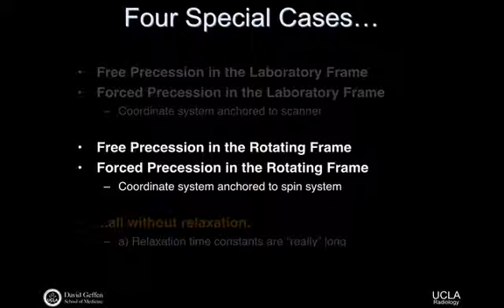Okay, so I'm going to clean this up, and then we're going to look at the equations themselves and hopefully get to the solution. So we come back to the equation of motion, which is that cross-product determinant-looking thing. But now we actually know what our B1 fields are, and more importantly, what our B effective field is.